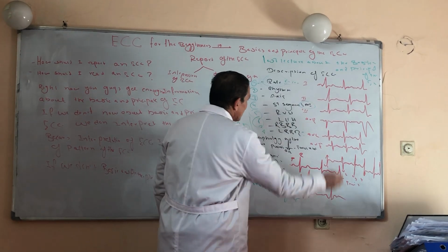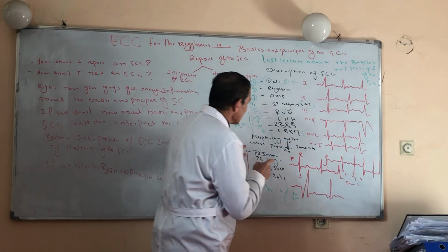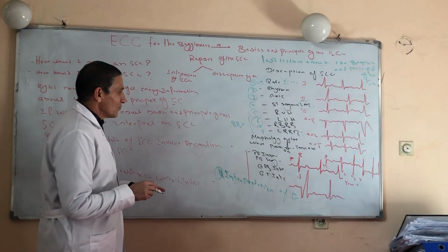Right bundle branch block. We will have a nice discussion about the right bundle branch block in a future lecture, and also about the left bundle branch block.